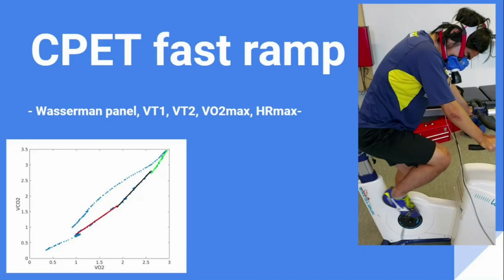Today I'm gonna analyze CPET Fast Ramp data, and especially I'm gonna talk about the Wasserman panel, VT1, VT2, VO2max, and heart rate max. First of all, I'm gonna show you the setup for the CPET.